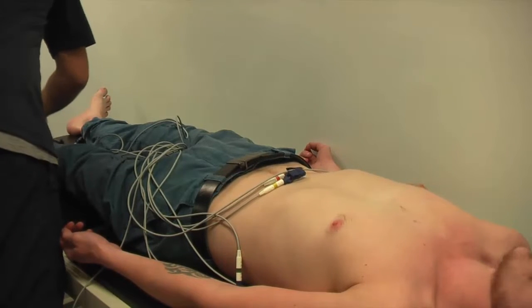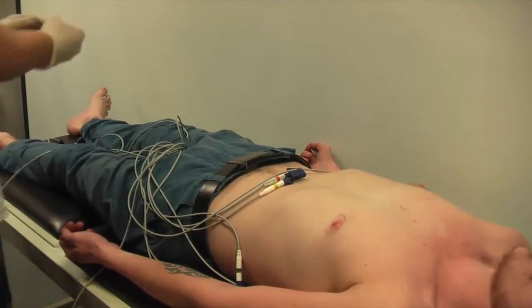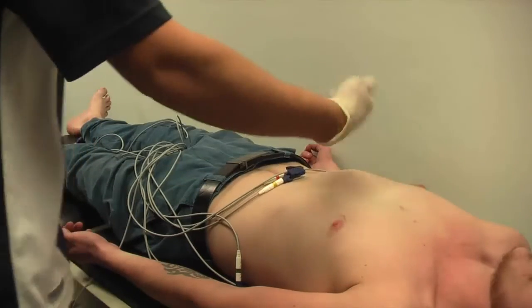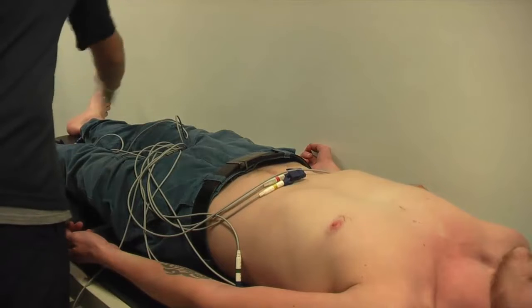Once you've applied the alcohol wipe to the patient's skin, you need to allow it to dry, because the electrodes won't stick effectively to any alcohol-soaked skin.